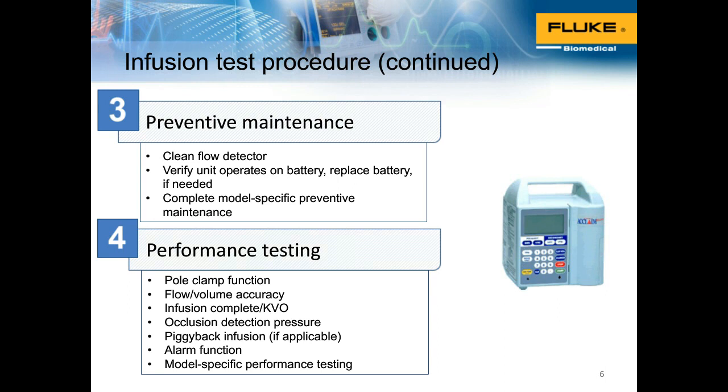We recognize that. And then, of course, there's complete model-specific preventative maintenance that a manufacturer will issue in terms of the other steps you need to take. This is a little bit different because the next section, usually in a service manual, is performance testing. Performance testing gets specifically into the things you need to measure as far as the performance of the infusion pump goes. So here we're talking about the flow and volume accuracy.